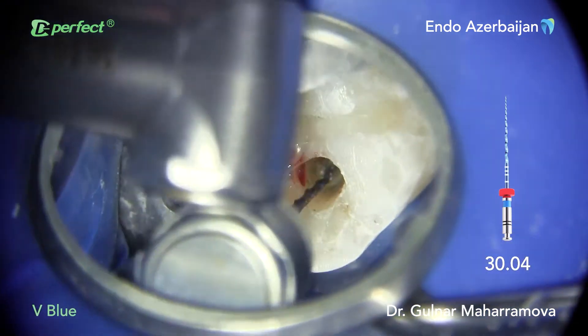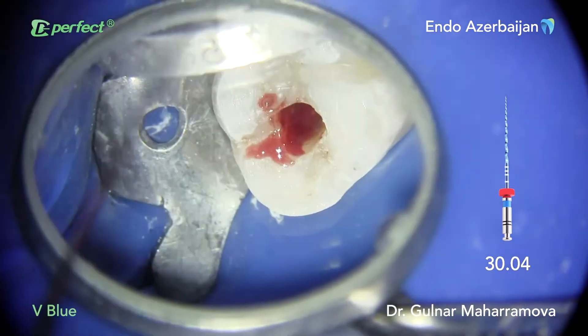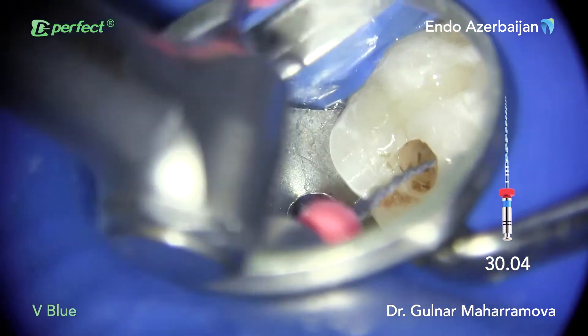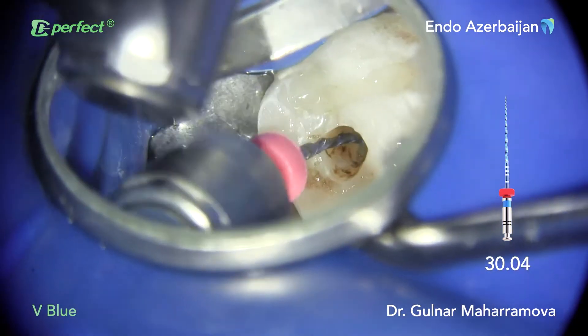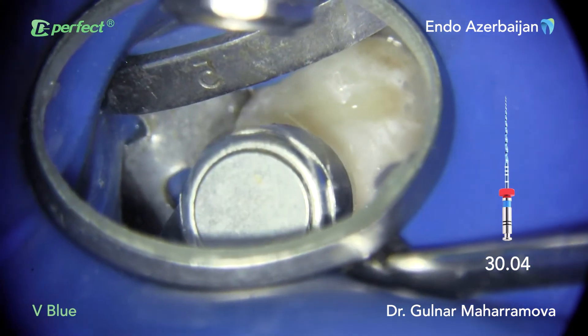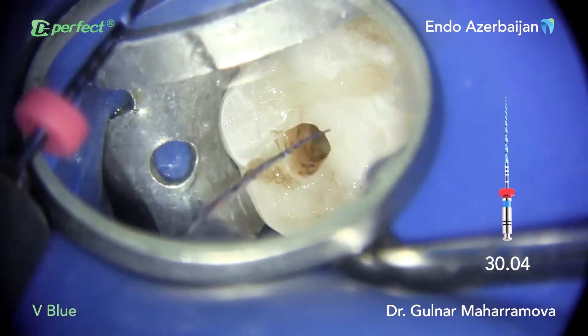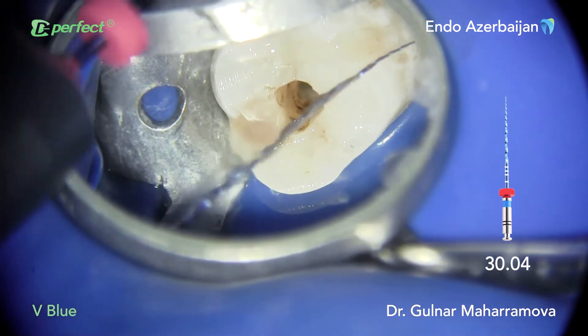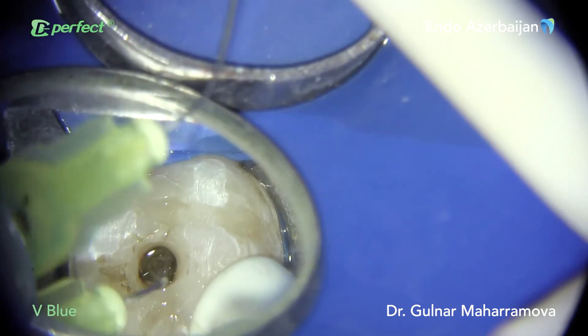You can see the pulp tissue removed during creation of the glide path by a rotary file. Due to the high flexibility and cutting efficiency of VBlue files, we can continue with 30.04 to resistance or straight to the working length. I managed to shape the main canals to the entire length in one go.